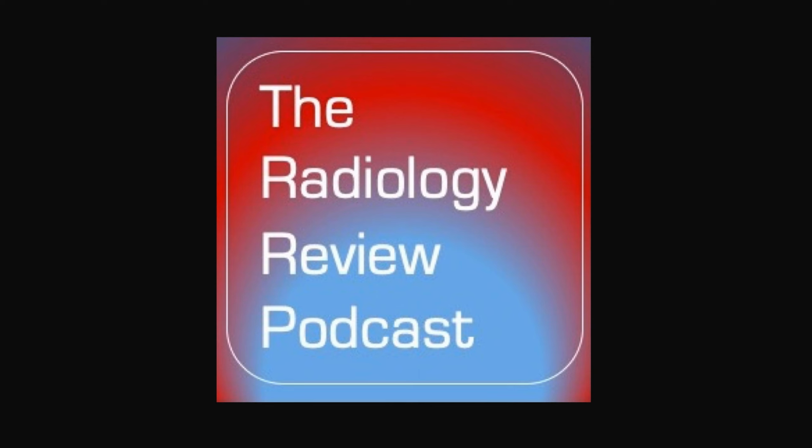So remember, on the first post-therapy scan, new or increasing areas of uptake on a bone scan can be either progression or a flare response. And what you need to do is then wait for the next bone scan to see whether things are getting better or worse. Next question. What is the classic imaging appearance of a sacral insufficiency fracture on a bone scan?